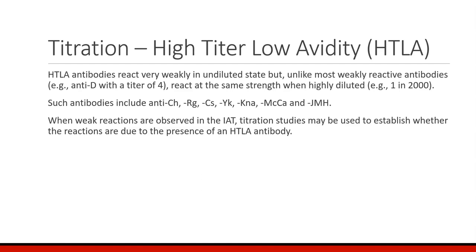They're plus minus when you test them with regular serum, and then no matter how far out you dilute it, I'm sure there's a limitation, but at an incredibly high dilution, these will still react plus minus. And that's why they're called high titer.